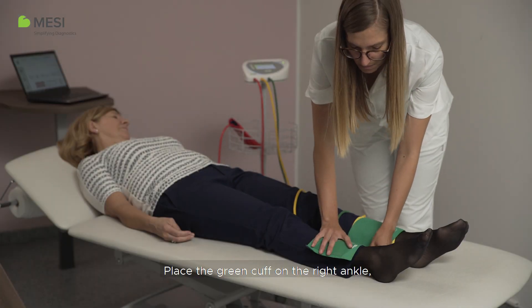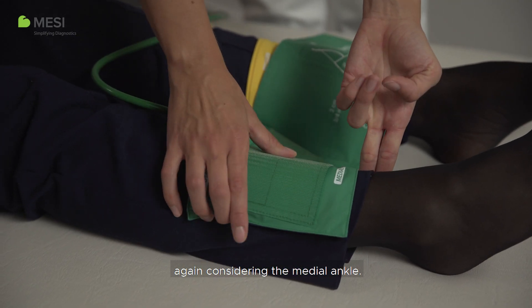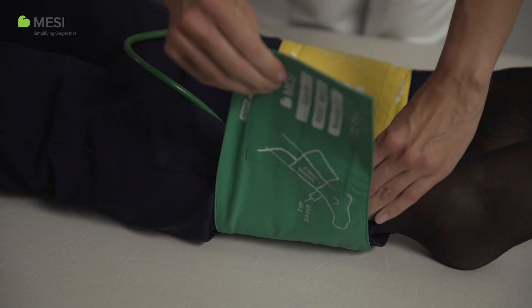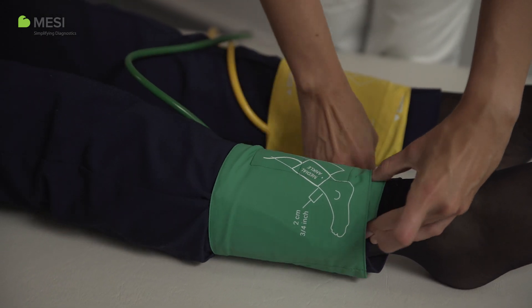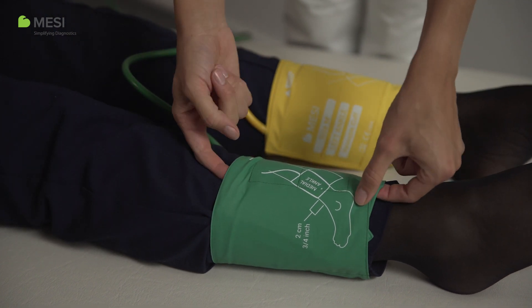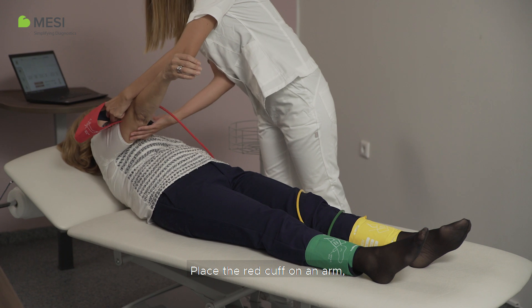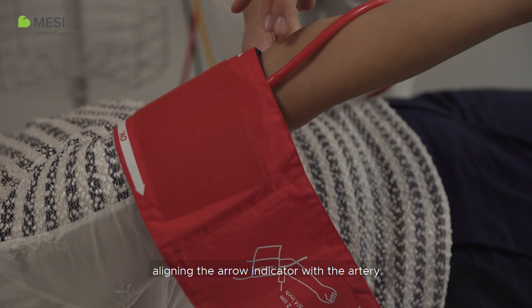Place the green cuff on the right ankle, again considering the medial ankle. Place the red cuff on an arm, aligning the arrow indicator with the artery.